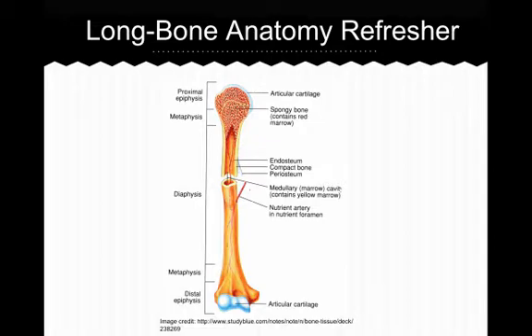The medullary cavity does not transmit ultrasound well, so only the compact bone on the side closest to the ultrasound can be seen well. The bone is covered by a thin sheet of periosteum, which contains the pain fibers that get activated in the event of a fracture.